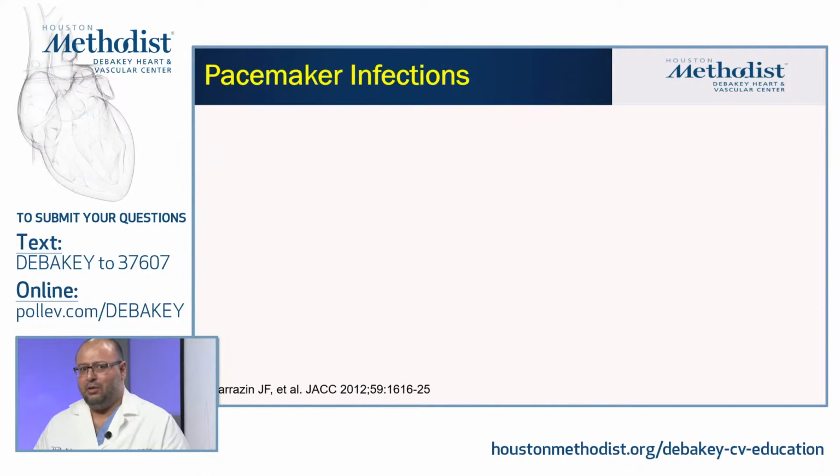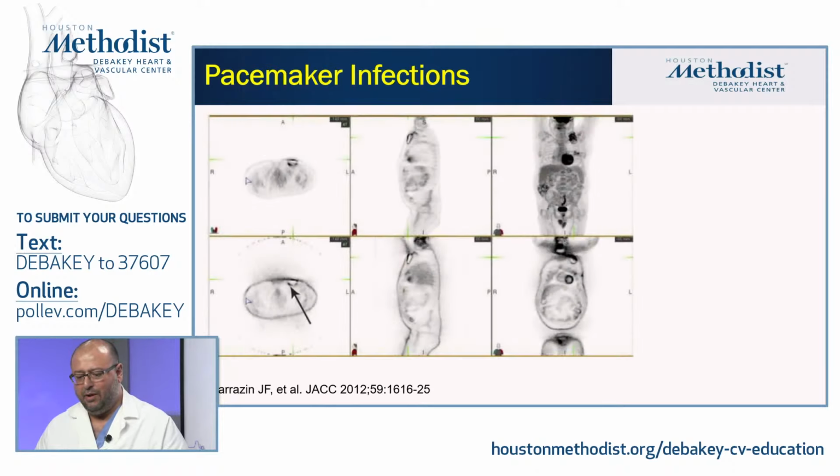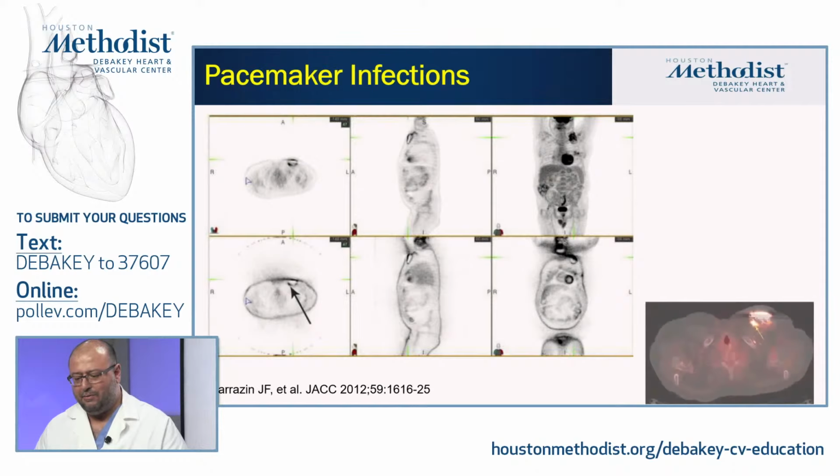FDG PET is not only for valvular endocarditis, we also look at pacing devices and their leads. So here, for example, is a bad pocket infection that you see here, and you can see the FDG uptake up there, and you can see also the pacemaker pocket infection that had significant FDG uptake.